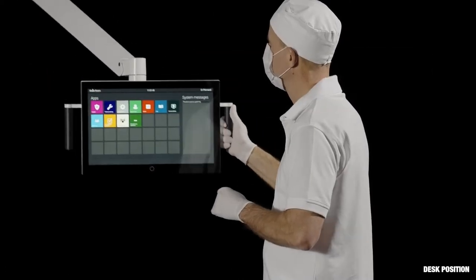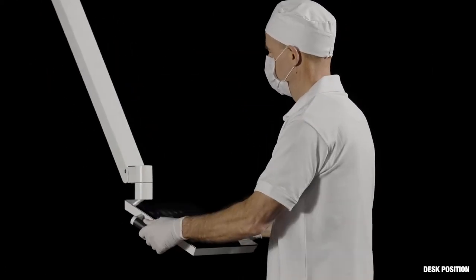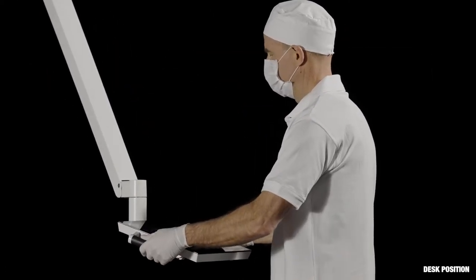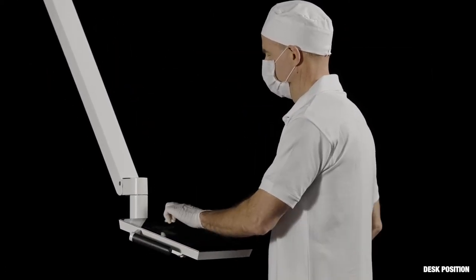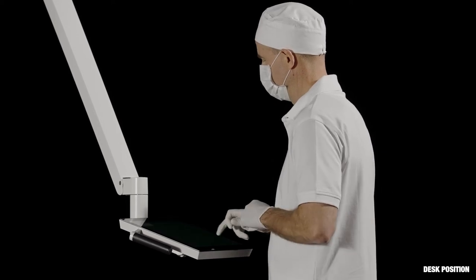For better access to the virtual keyboard, tilt the navigator to the desk position.